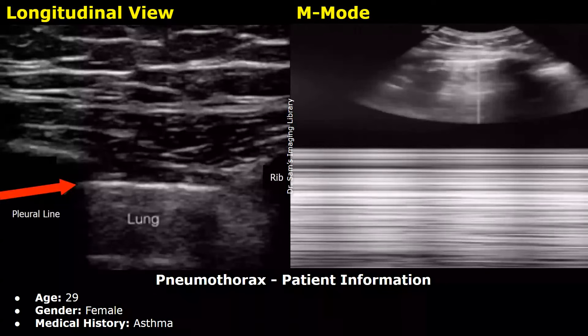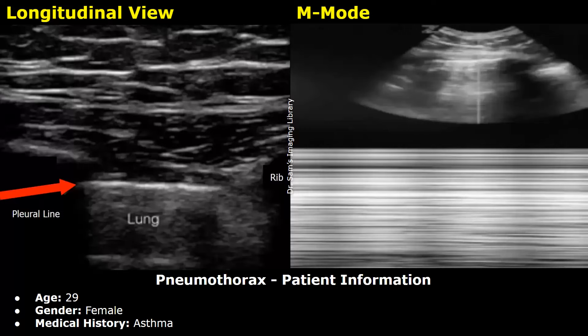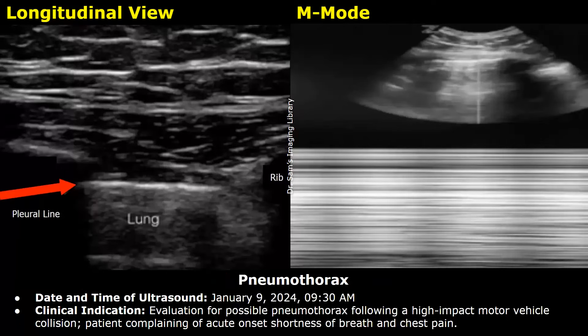Now we have a report for an extended FAST exam, in which the lungs are also scanned. Here is a case of pneumothorax. Patient information: age 29, female, medical history of asthma. Date and time: January 9, 2024, 9:30 AM. Clinical indication: evaluation for possible pneumothorax following a high-impact motor vehicle collision, patient complaining of acute onset shortness of breath and chest pain.